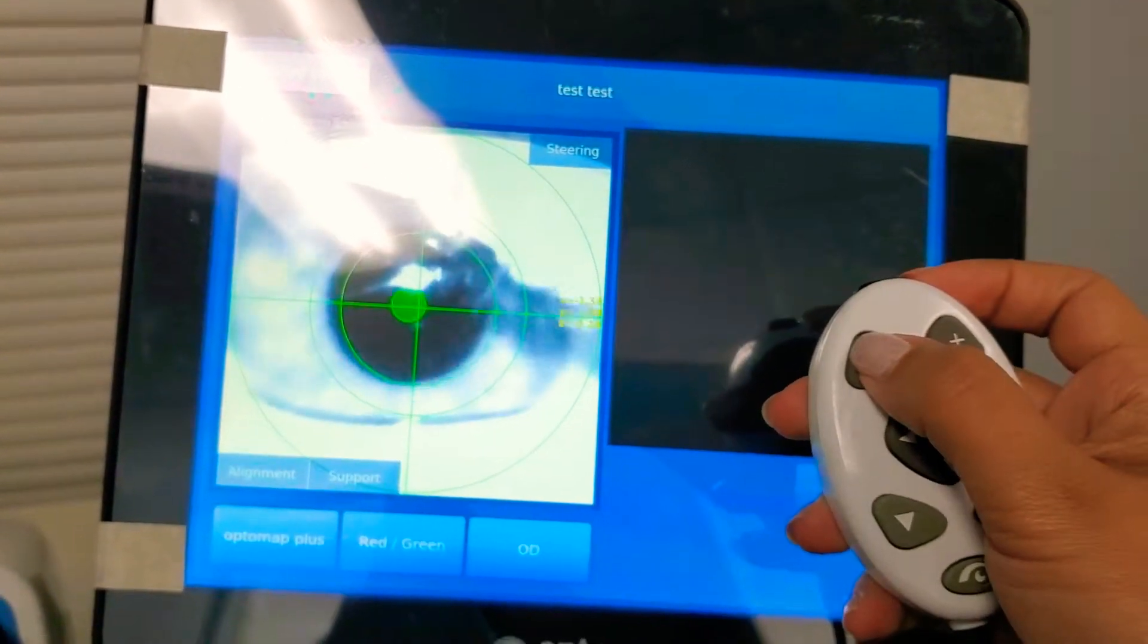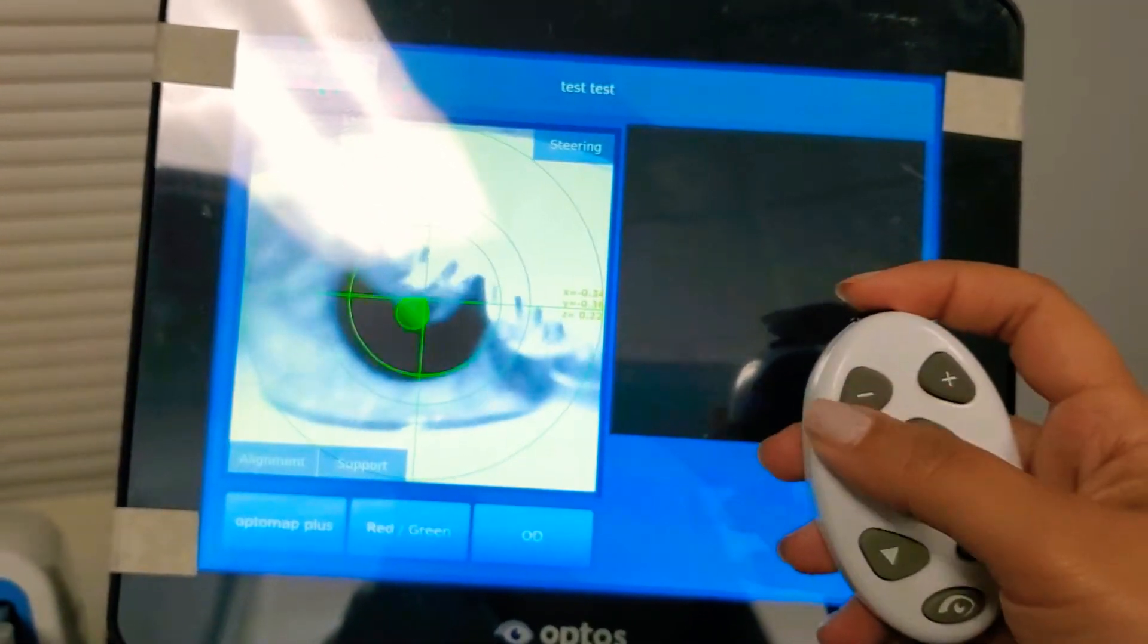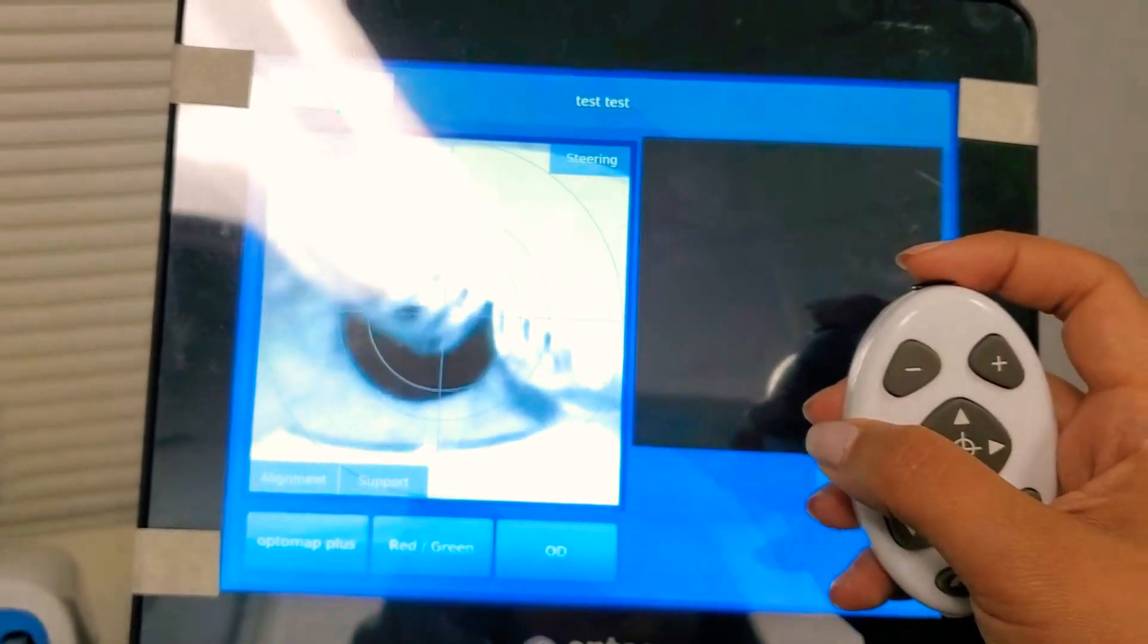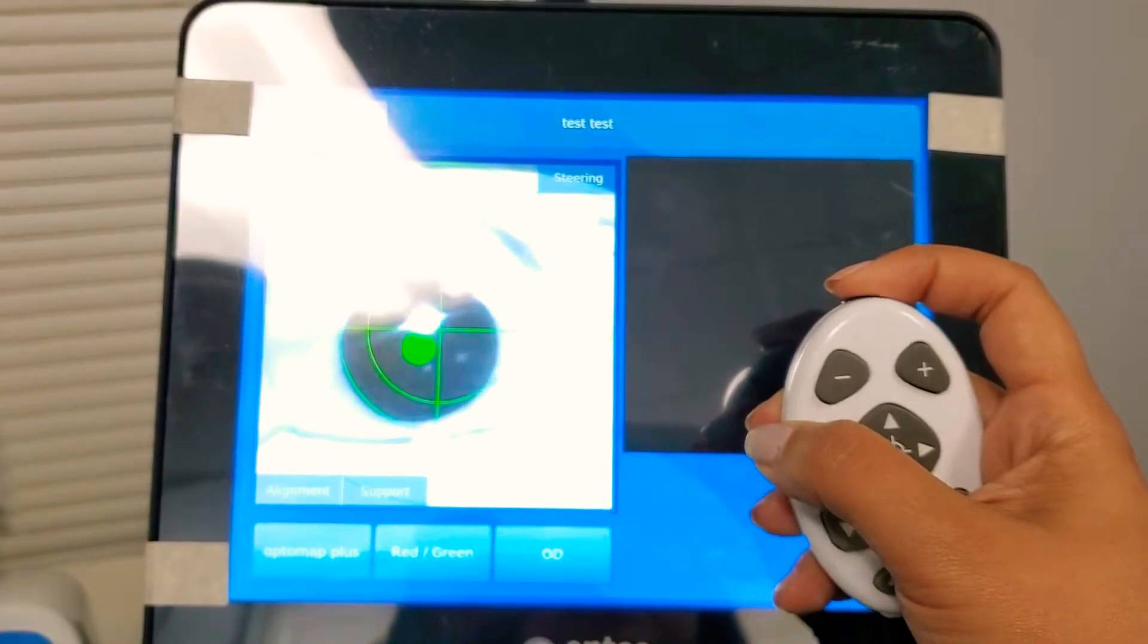And we want the color to be green. All right, and we can go zoom out, zoom in. We want green. And once it's there, here's to capture. Ask the patient to open their eye wide. Open wide. One, two, three.